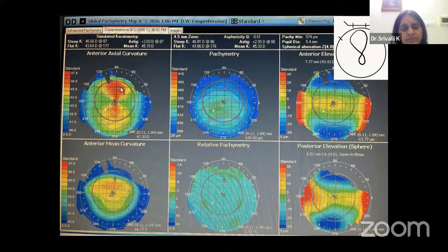It's a good case to end with, just to show you that you don't have to think that because we are postgraduates, all this Pentacam and refractive surgery is beyond us. It's okay if we don't understand. That's why Dr. Anil has put this simple case of SICS, done most likely by one person like you, and this will cause changes. So when you are doing even a simple procedure and when you are starting your cataract surgery, please try to understand all these aspects.